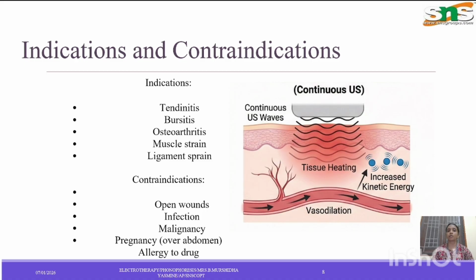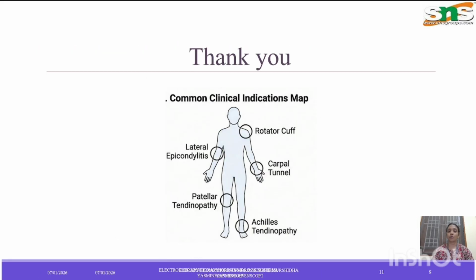So that's all about phonophoresis. Phonophoresis can be done when there is a need for the patient, with proper selection of the drugs. Commonly clinically indicated conditions are rotator cuff problems, carpal tunnel, lateral epicondylitis, patellar tendinopathy, and Achilles tendinopathy. Hope you have understood about phonophoresis.